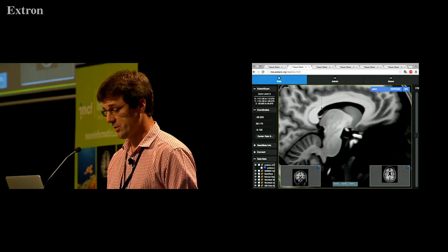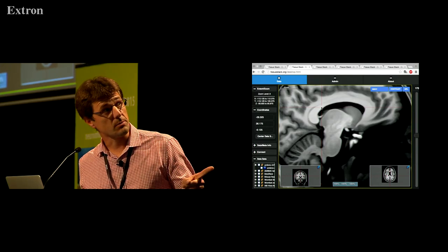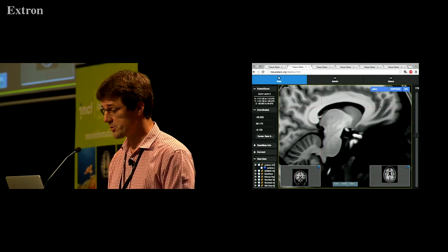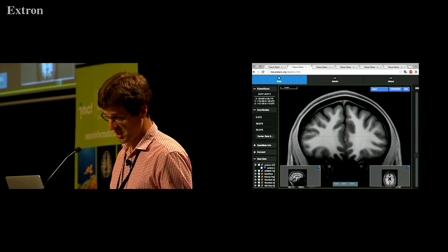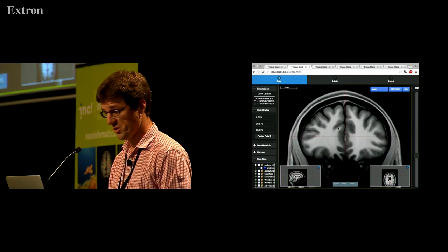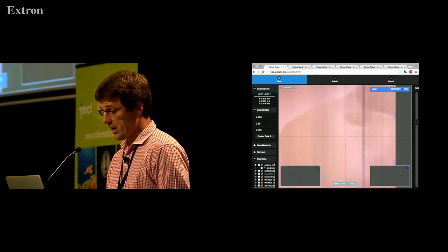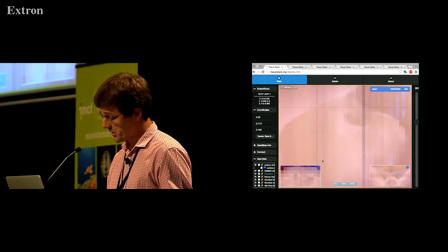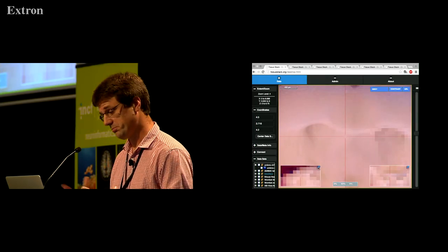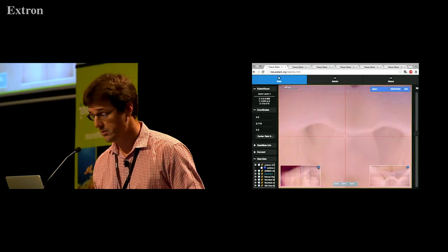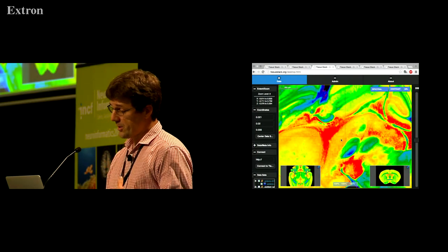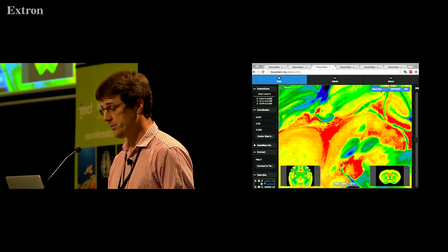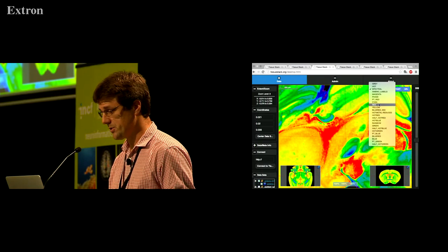This is a two gigabyte seven tesla average image of morphology and we can move around, we can change to different views, we can zoom in, we can zoom out, do all those sorts of things. This is some block face histology data which we can also load so we can swap the views and it will load it again. This is if we overlay a colour map on top of it, we can choose from our list of colour maps we wish to use.